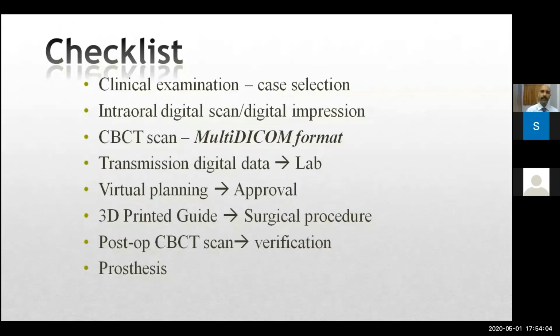There are multiple DICOM files, or a uni-DICOM format where a single DICOM file is there. But for guided surgery, we would prefer a multi-DICOM format. Both these data in the multi-DICOM format, from the CBCT scan and from the intraoral digital scan, are then transmitted to the laboratory. In the laboratory, the virtual planning is done on Exoplan software like Dr.